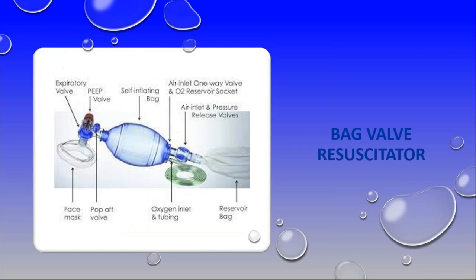This is called a bag valve resuscitator. And I have to spend some time on this because there is so much confusion with regards to how this is used, how it is put together, and what people do that it is quite scary. So the first thing that we need to know is, is this mask appropriate for the face that we are going to have?